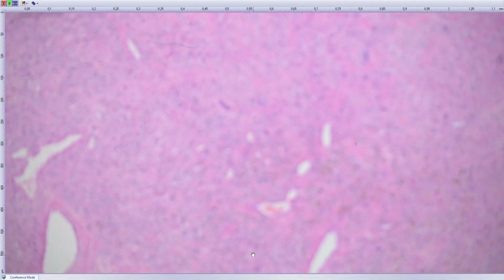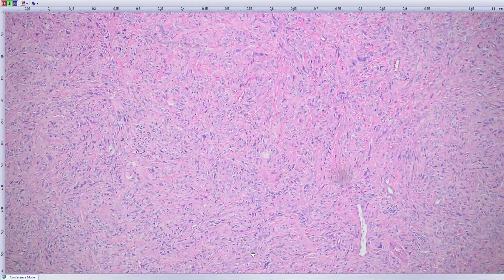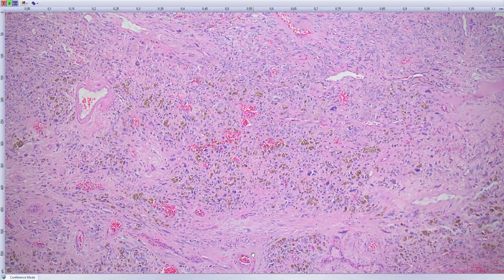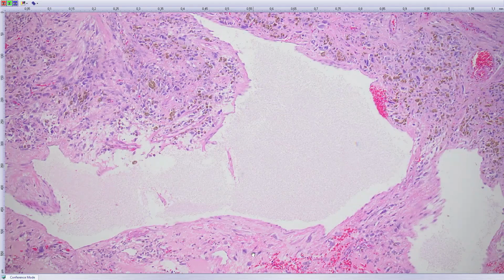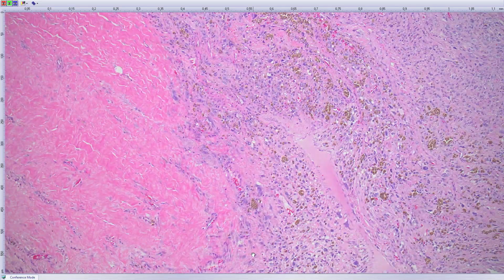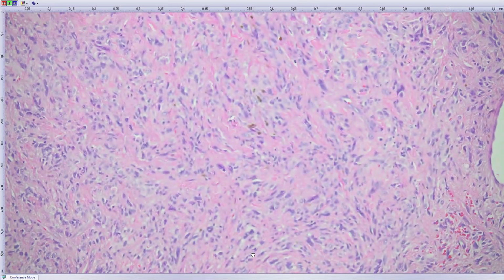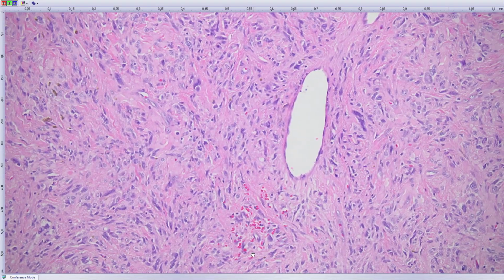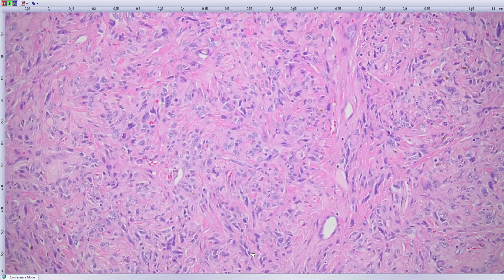Now I have a patient, an older patient with a subcutaneous lesion, making these angiomatoid structures which do not make typicality of the tumor, and hemosiderin deposition, so it's not melanin, it's hemosiderin. And the tumor is very important to know and diagnose. You see, it's very dysplastic. You do not see many mitotic figures, yeah, when you look at them, but you see huge proliferation, huge atypicality within the tumor.